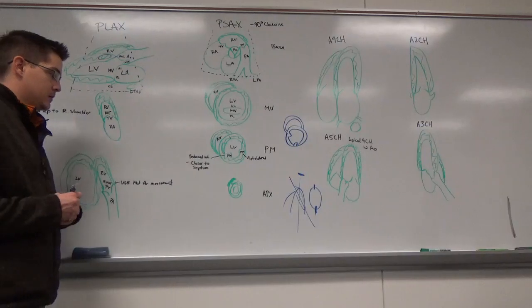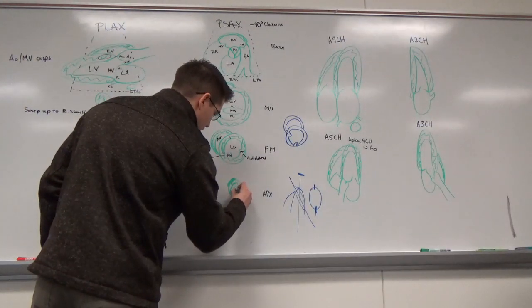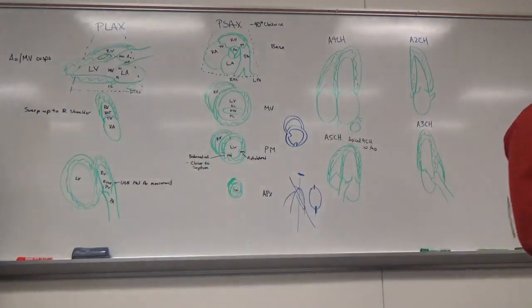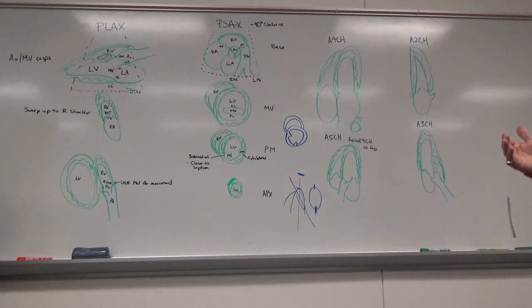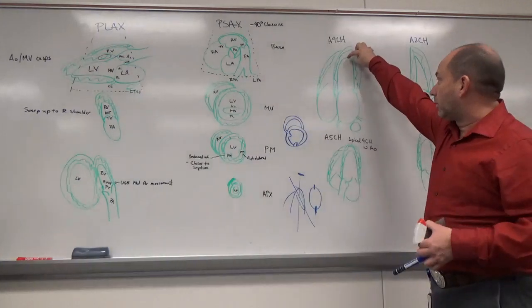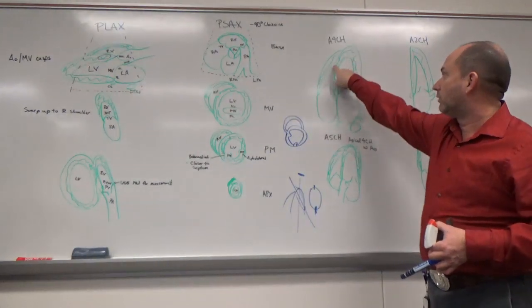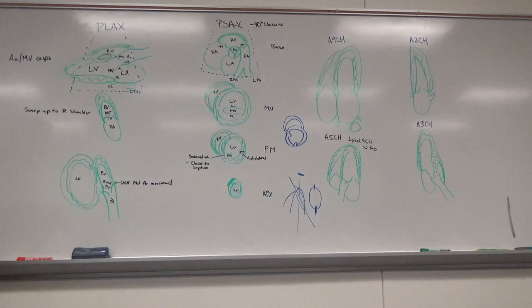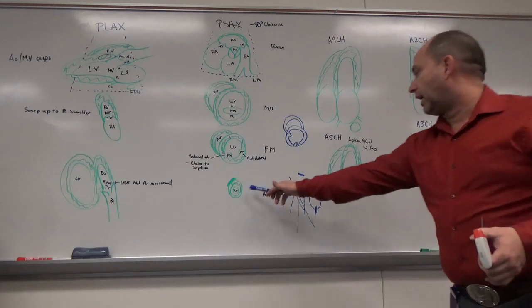And then the last one is LV. Okay, so I kind of drew this little thickening of tissue around here. Why would I draw that? Right ventricle. That's where the septum is, but when you're truly at an LV apex, you really don't have much of any. There's no chamber left on the RV. Because if you look on this, I almost always draw on an adult heart, I always draw the LV higher than the RV apex. Because it is. Except when there's something wrong, then it becomes equal or even bigger than the left side. And that's problematic. So if I am seeing that at that level, that's problematic. Okay? So that's what it should look like roughly.